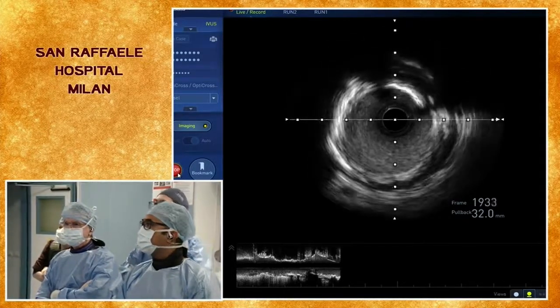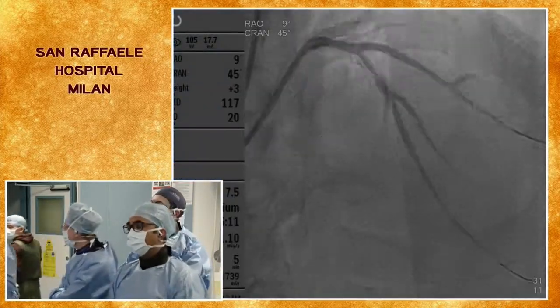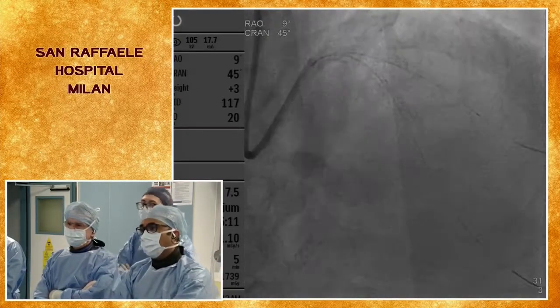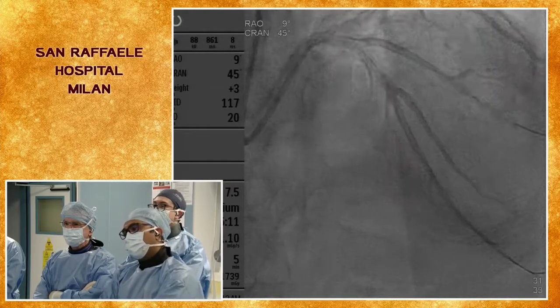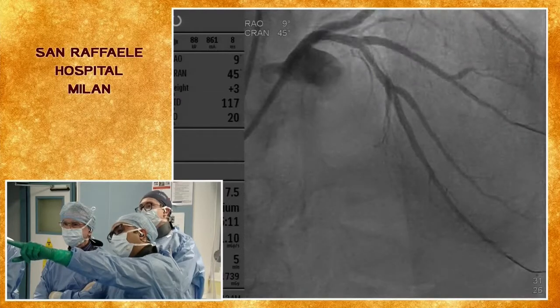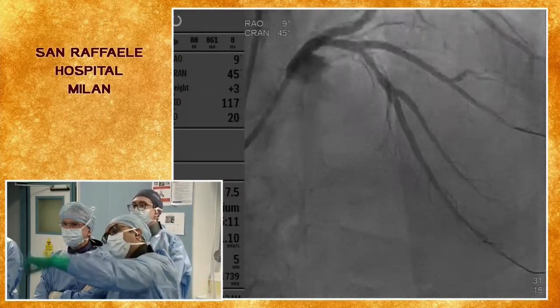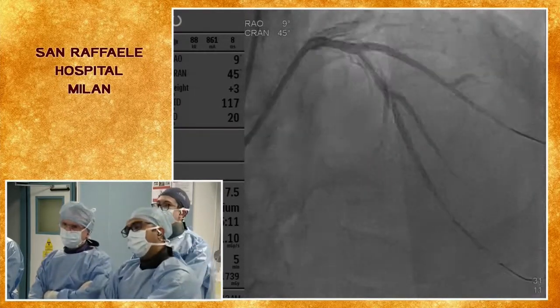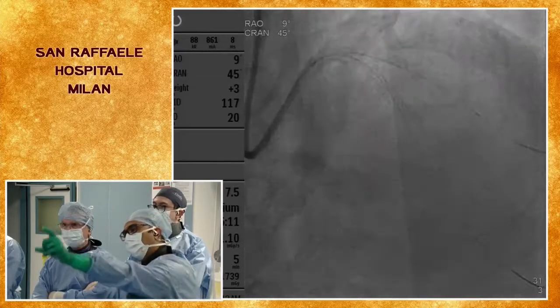One second, let's just see. Okay, we've seen this. Stop IVUS, and let's see the angio now. So this is the angio. I will probably use a drug-eluting balloon. A dissection distally. Because if you look where the worst part is, it's actually inside the previous stent. So maybe a drug-coated balloon is not better. A 3.0 by 30 drug-coated balloon. Yeah, 30. We do the whole area.